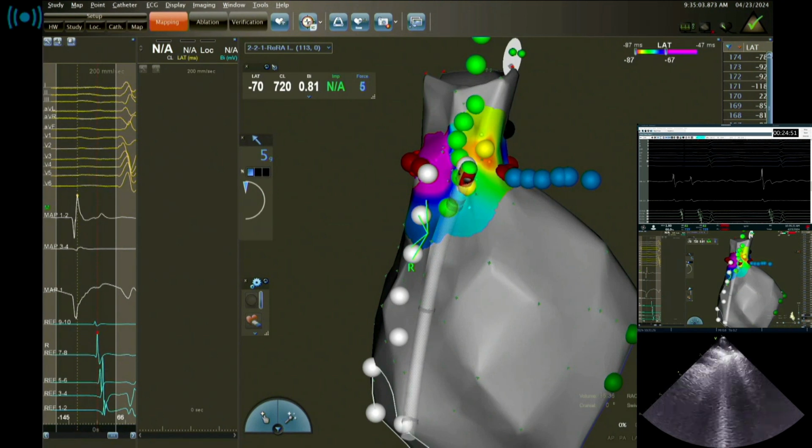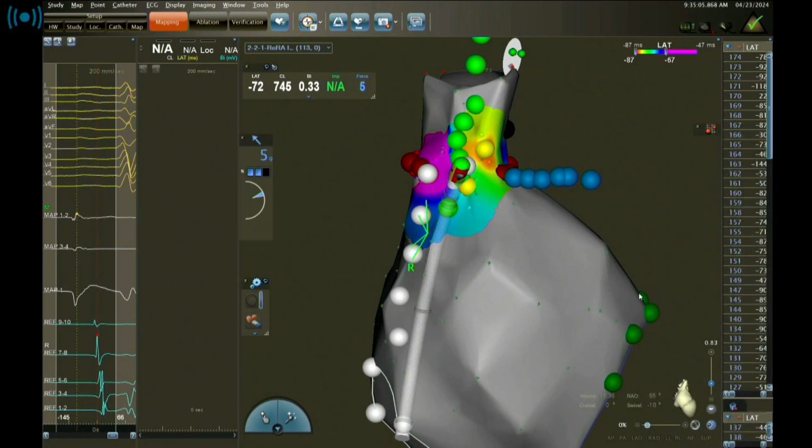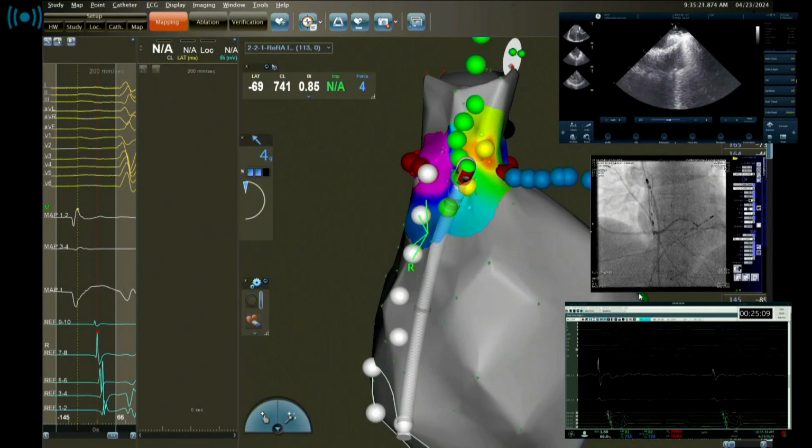Left ventricle retrogradely, you have to be careful because these are sitting just at the level of His bundle, so you can create a temporary block, complete heart block. All right, so if you rotate the map, you will see that these rings are away from the myocardium.